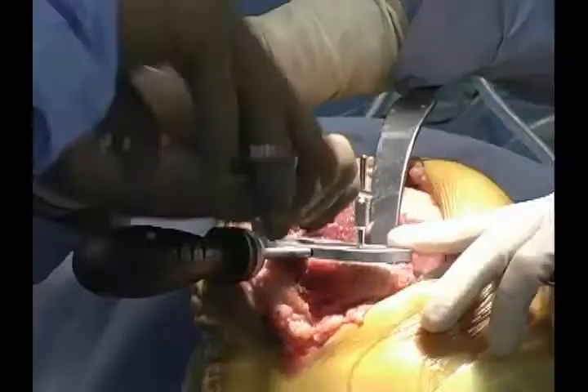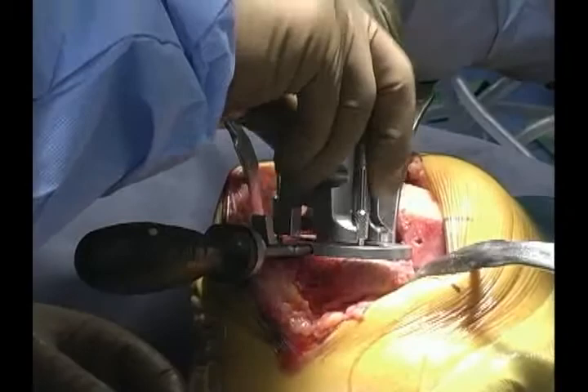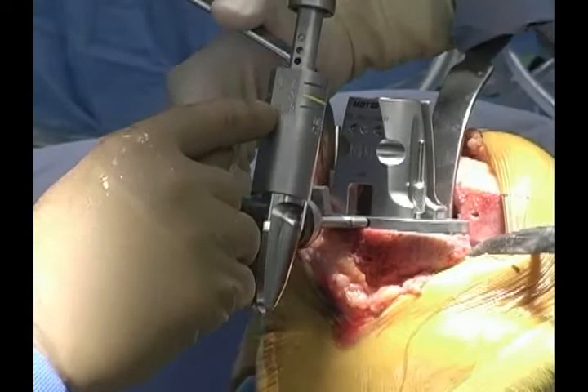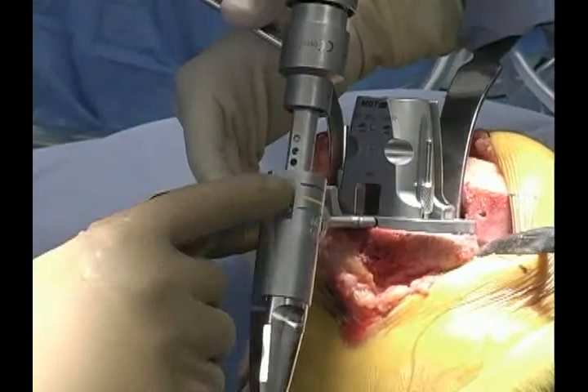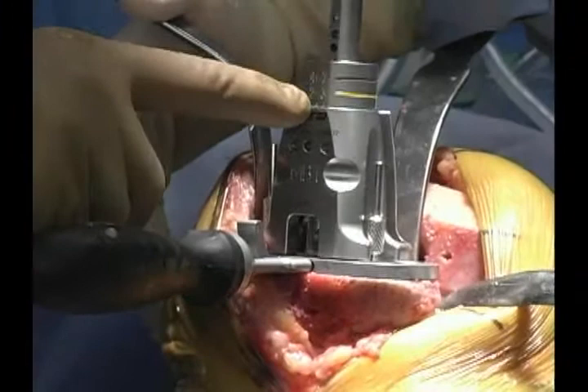We have a set of pins that allow us to fix the tibial tray — they don't need to be seated all the way. Then we have the tower for the drill guide that goes over the top. Make sure that's seated fully. The drill is size-specific: sizes 1 to 1.5 use the green line, 2 to 3 is the yellow line, and 4 to 7 is the red line on top. In this case it's a size 4, so we drill down until the line reaches the top of the drill tower and stop at that point.